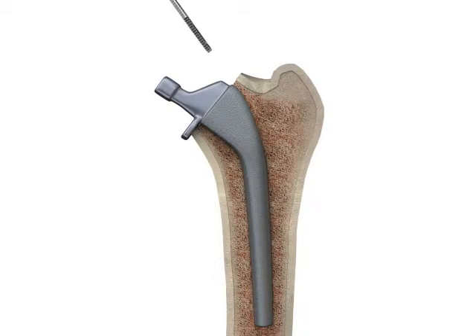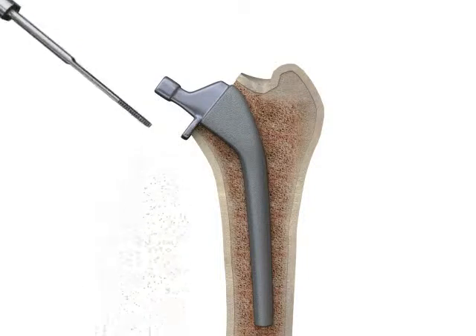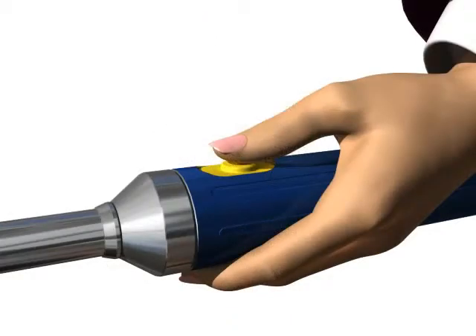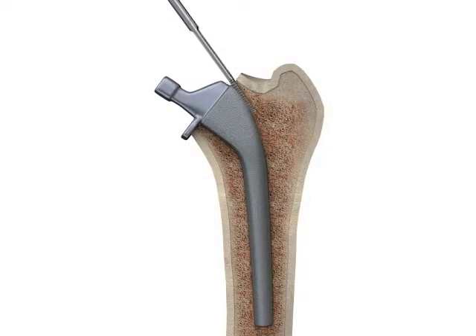Once the slots are created, the 6mm flat serrated probe can be used to break the interface of the remaining bony ingrowth. Activating the probe before entering the slots will provide optimum performance, and a manual sawing motion may be needed when cutting cortical bone.